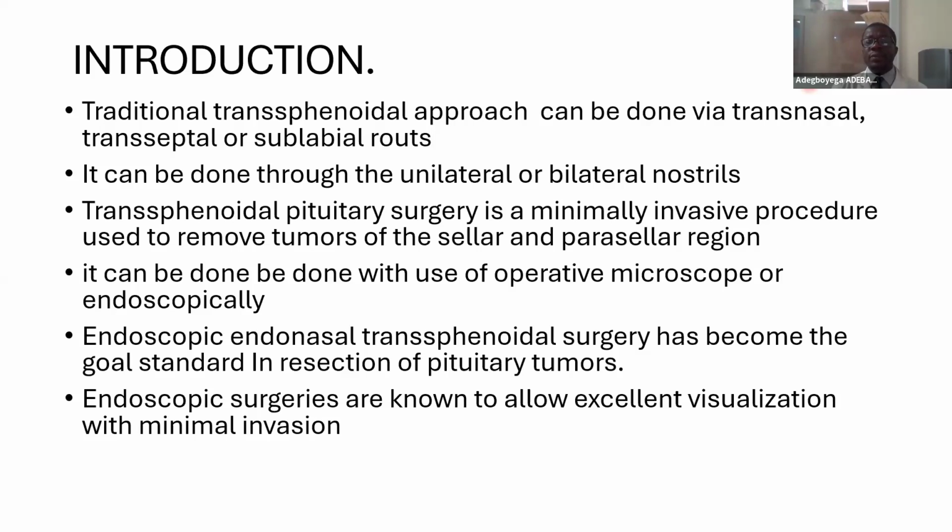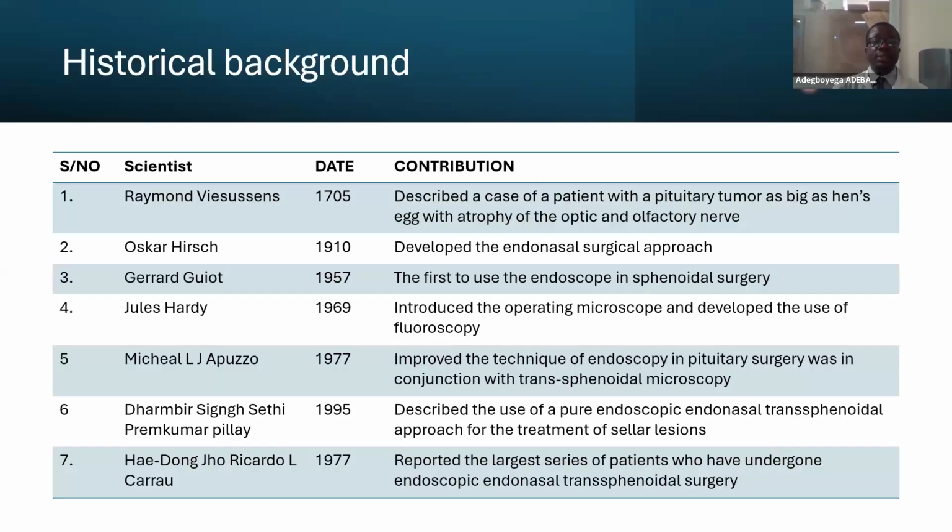Endoscopic endonasal transsphenoidal surgery has become a major gold standard in the resection of pituitary tumors. It is well known for the excellent visualization and the minimal tissue invasion that it offers in patient management. The list above just shows a brief historical background of the procedure.